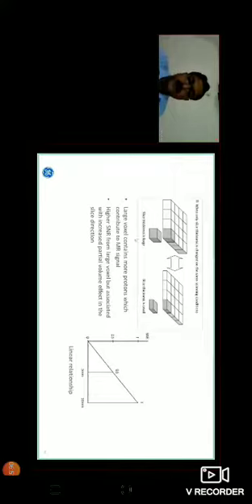But if you see in the 2 mm slice thickness, we can see the better gray white matter differentiation. So the spatial resolution means the ability to distinguish between two separate tissues. Okay, so we'll discuss. Just assume we have a 4x4 matrix image. You can see the slice thickness is large, or the voxel is bigger. It can accommodate more number of protons. That means you will get more SNR.